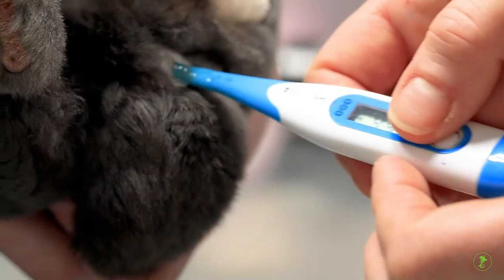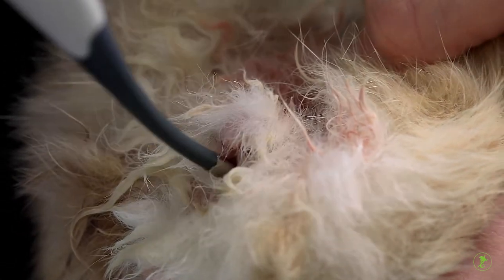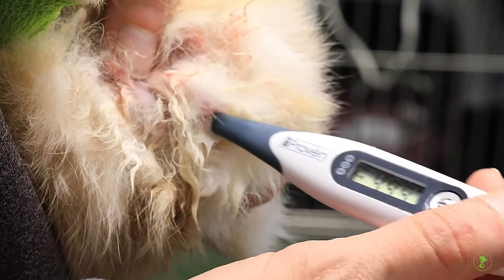Push the button and wait for the beep. If the thermometer is not inserted deeply enough, the reading may be abnormally low. However, you should never force a thermometer in deeper if it doesn't seem to want to go.